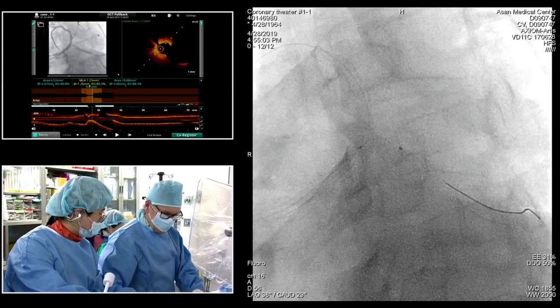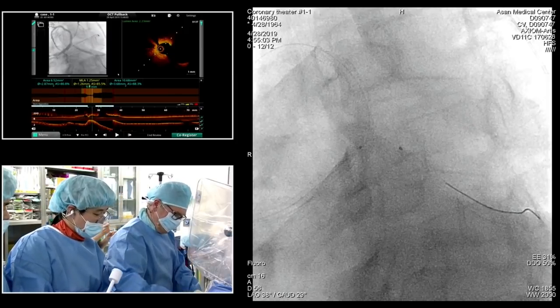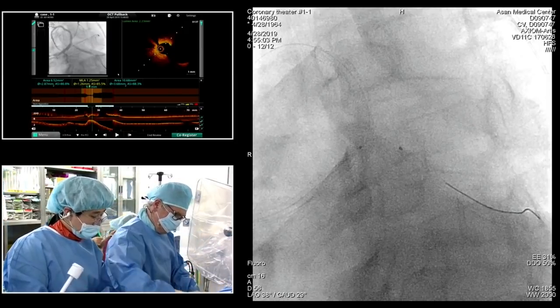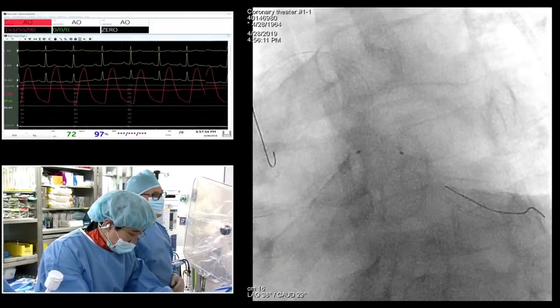So this one, usually we perform kissing firstly and then DCB. Dr. Chen, is that your question? I will use a non-compliant balloon kissing first.